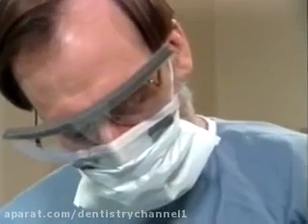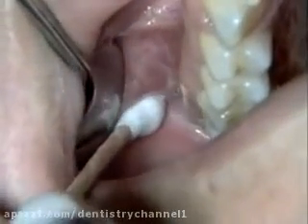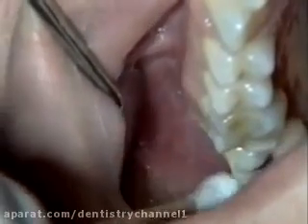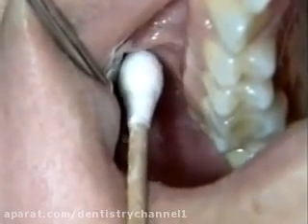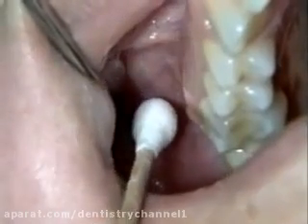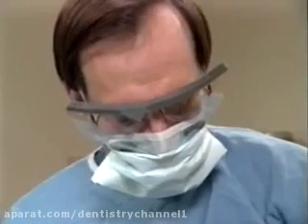The needle puncture point is in the height of the vestibule immediately behind the zygomatic process. It is normally situated between the distal buccal root of the second molar and the mesial buccal root of the third molar. The zygomatic process is easily identified by gentle palpation buccal to the first molar. As the probe is moved posteriorly, it falls behind the process, indicating the insertion site. The distal boundary of the zygomatic process is palpated.